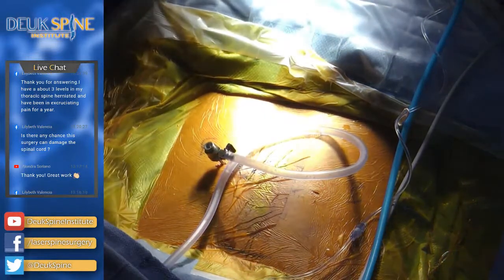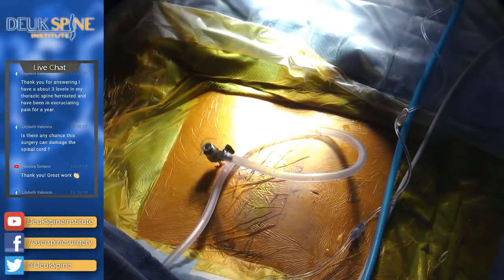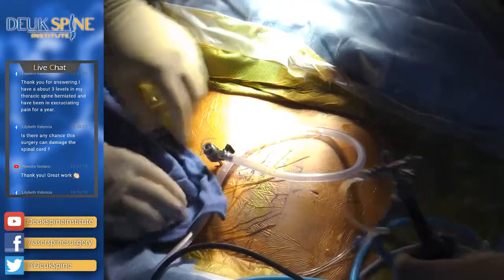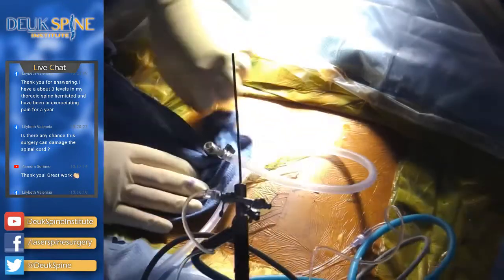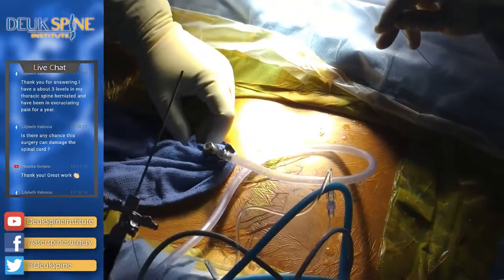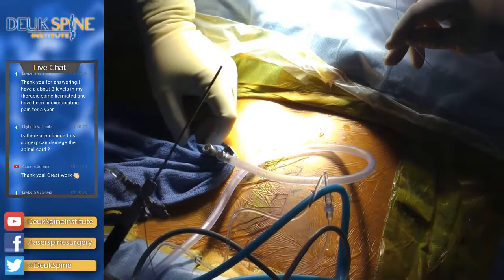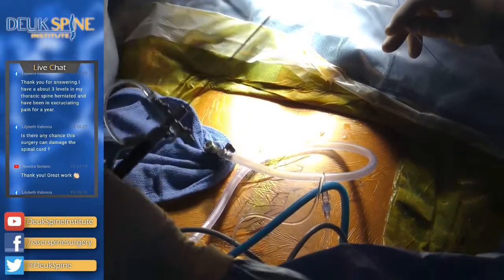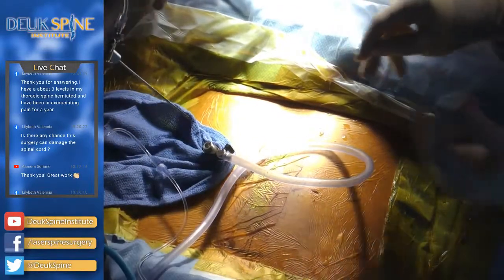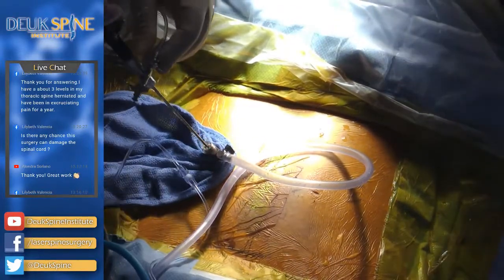All right, let me have the rig. Any questions from our audience? None currently. So what I need is, see this blue towel goes down into the bag? That way all the water tracks through the towel down into the bag. All right. Luis has been a tremendous help.